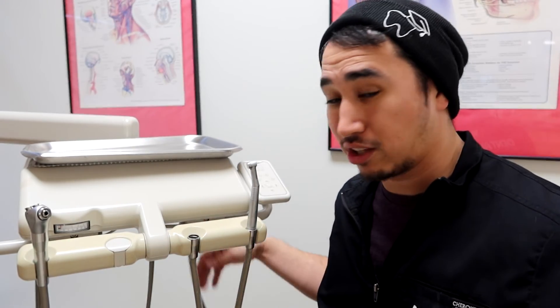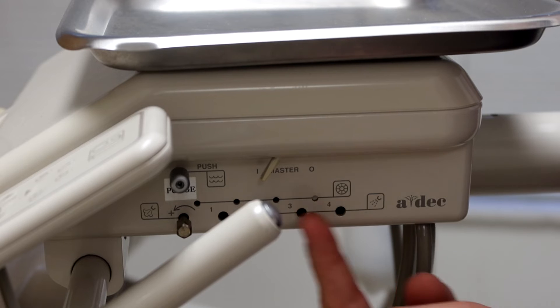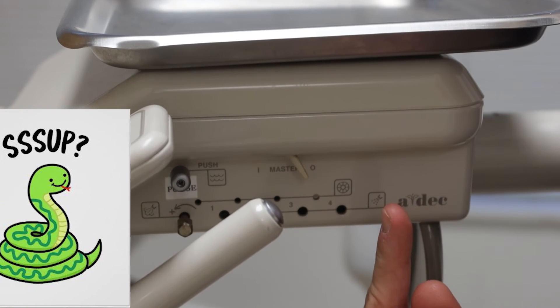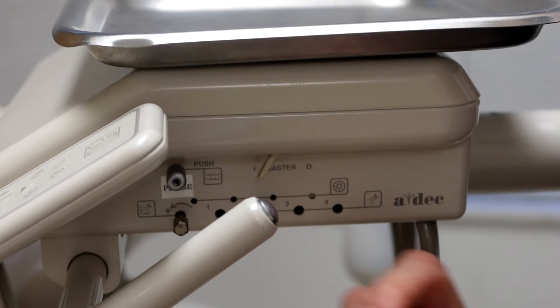Another troubleshooting item is the master switch — make sure there is actual air pressure to the whole unit. Depending on your unit, you can find this master switch on the side. Whether it's facing to the 'I' meaning on or the 'O' meaning off, flipping it will produce a hiss as the unit depressurizes or gains pressure so you can use the handpiece properly.